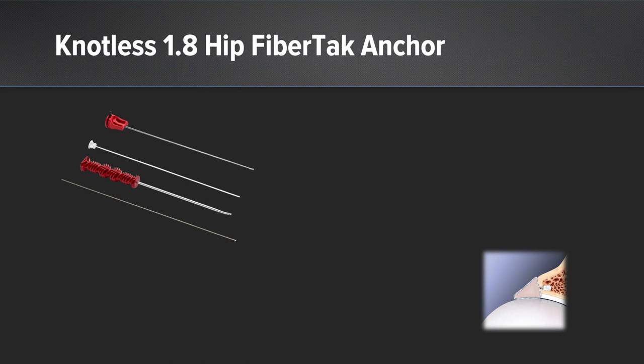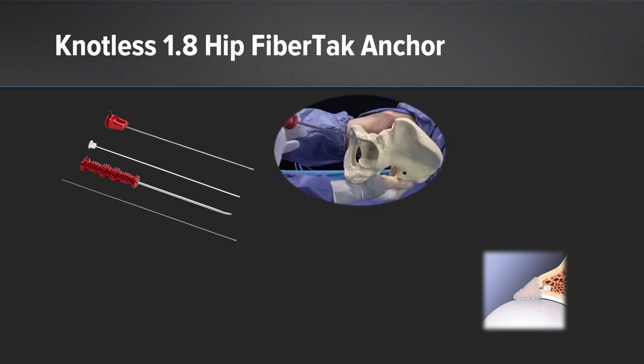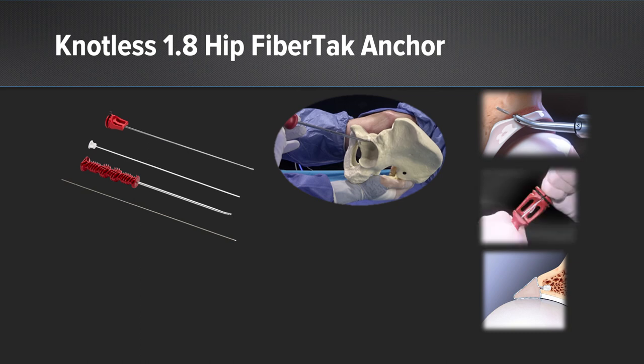We have known from prior studies that the very anterior aspect of the hip, from approximately the 1 o'clock down to the 3 o'clock in the psoas U, that bone is very thin and doesn't leave a lot of room for inserting an anchor. And so having an anchor which is low profile, which is knotless, which reduces knot stack and additional tissue in the way, in addition to having a relatively small area of bone removal, is very important in this area. Beyond this, the use of a curved guide is very beneficial to allow you to access the hip in different positions, and ease of use is also very helpful to insert these anchors.